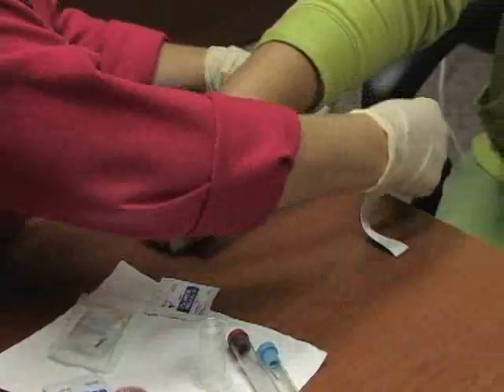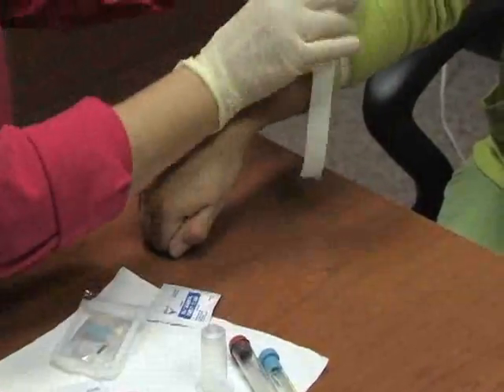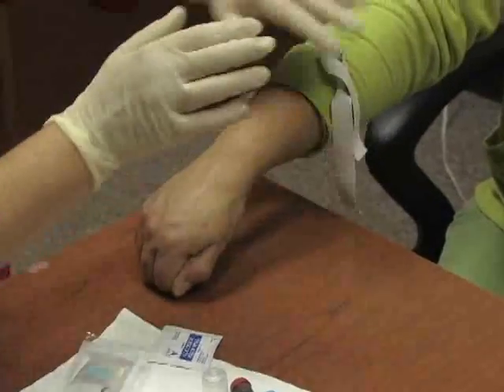The next procedure we're going to do is to draw peripheral labs. Get your tourniquet ready and apply your tourniquet so it can be easily released with a one-finger method.